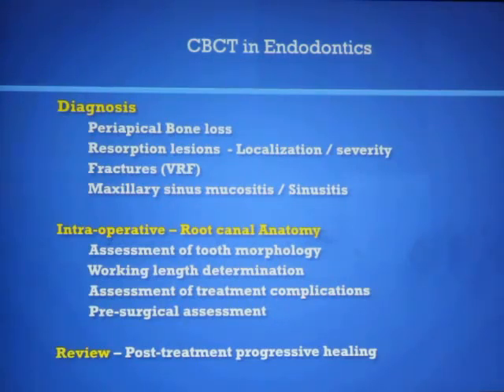And finally, it is a very important tool to review the follow-up of your treatment and confirm that the healing is progressing, so that our dentist colleague or a prosthodontic colleague can get going with the definitive restorations on the coronal portion.